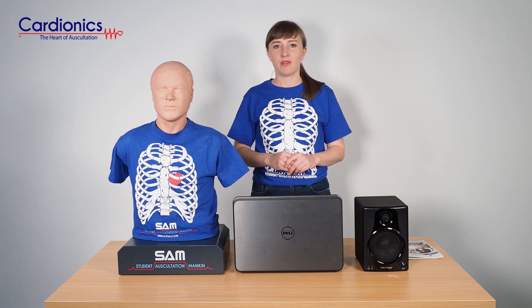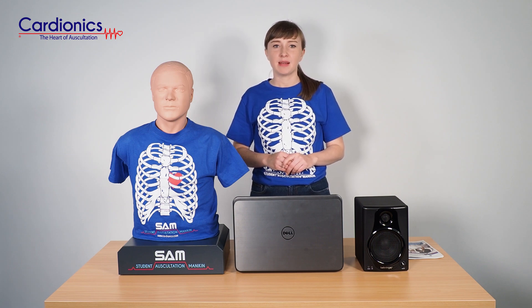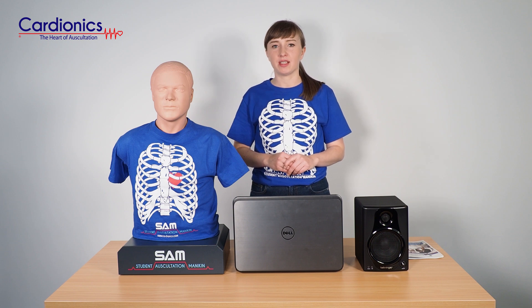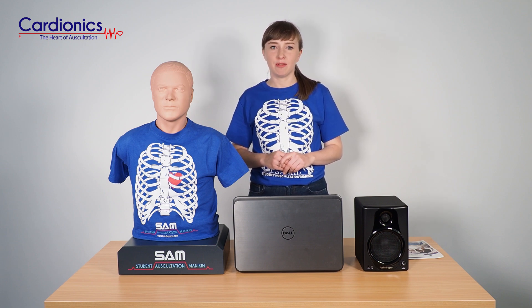Welcome to this SAM2 out of the box video. SAM2 comes with the following components which give you a complete solution to your Auscultation Training. Once you unbox your SAM2 you will find the following.